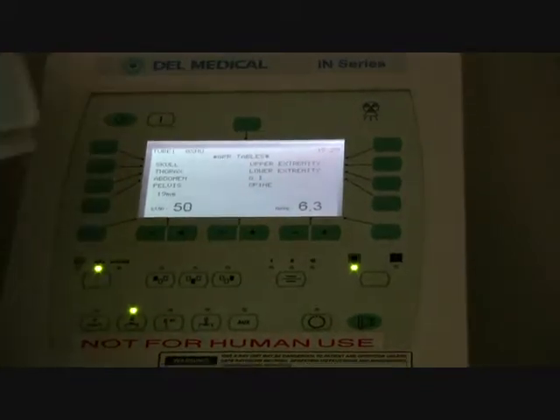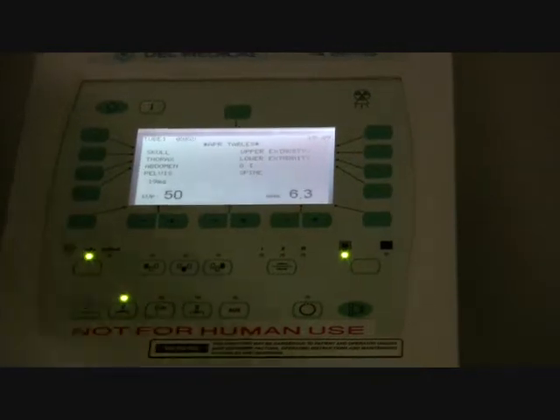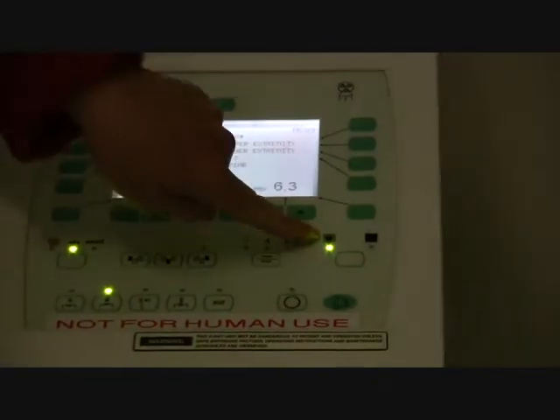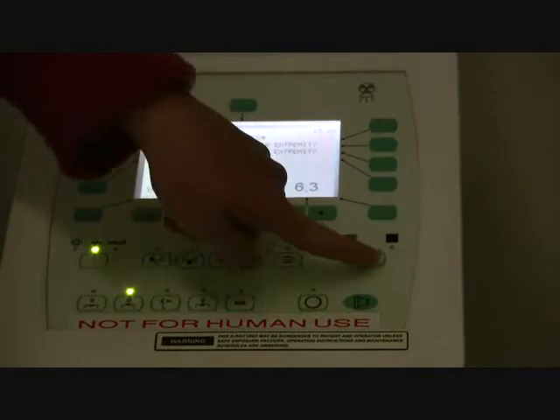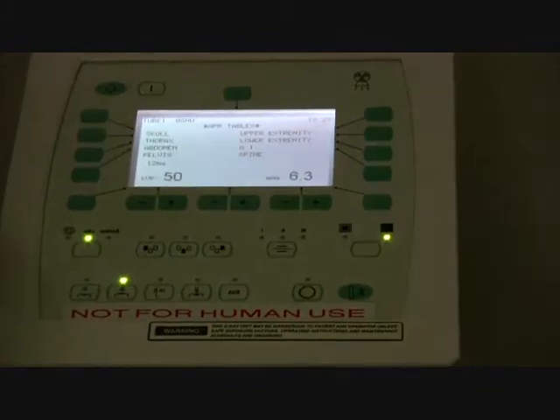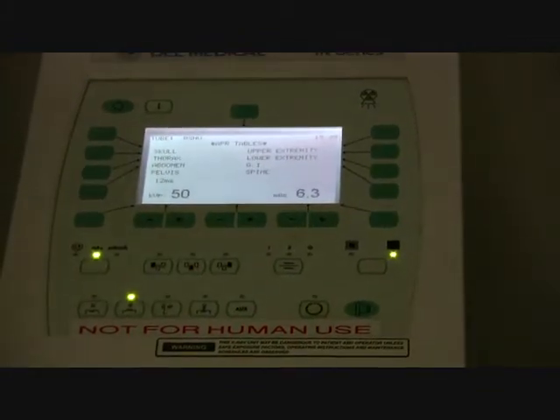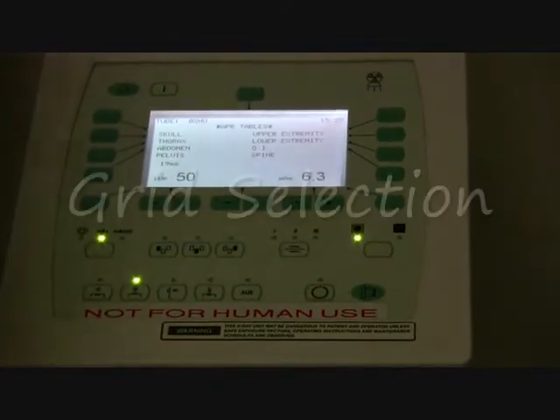All right, cool. So the next thing I want to talk to you about is the focal spot size. If we're doing something like digits, you want to have a small focal spot, which is this right here. It's the little boxes right there. If you're going to do something bigger, like a hip or a chest, then you have to go over to a large focal spot, because you're using the grid, and I'm going to talk about that in just a second. So there's our focal spot size.